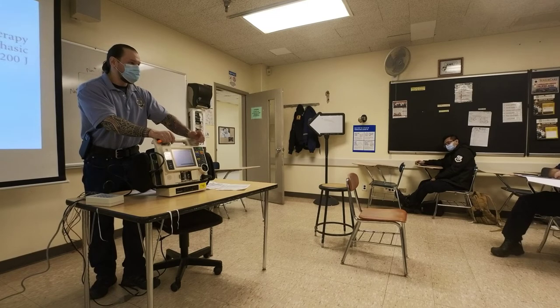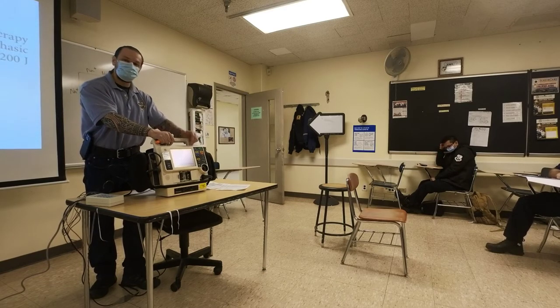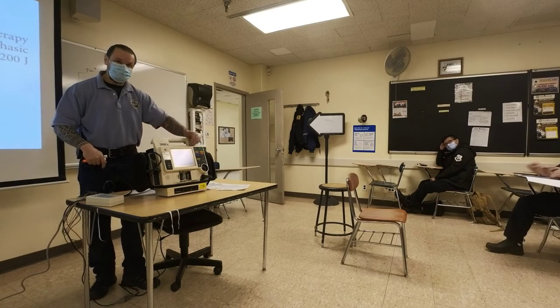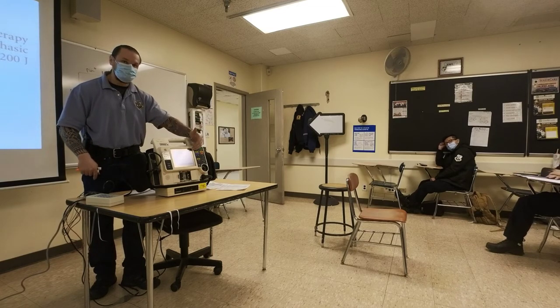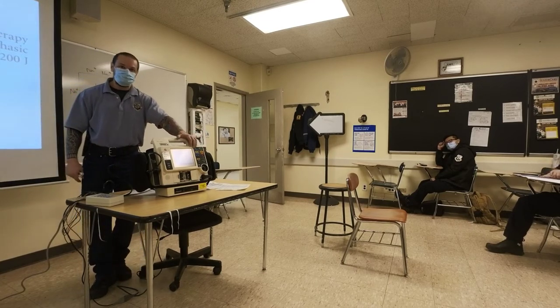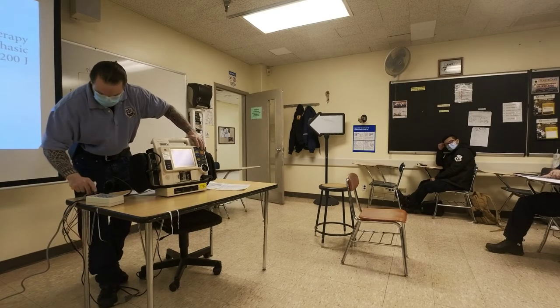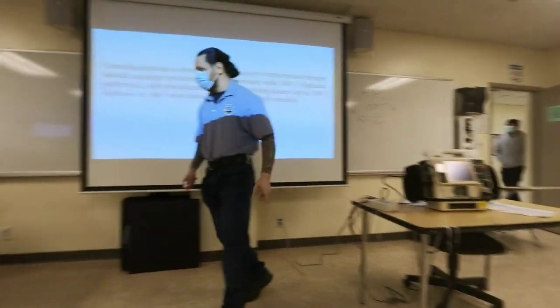So if your patient went to pulseless V-Tach or V-Fib, this monitor is already at a point where you could right away defibrillate, because it was a witness arrest. Let's say you had unstable ventricular tachycardia and you synchronized cardioversion at 100. You check your patient, there's no pulse, and he still has V-Tach or converts to ventricular fibrillation. The button's already off so you can just go to 360, charge, and defibrillate. Make sense? But make sure you know the monitor you're using, because that feature differs by model.